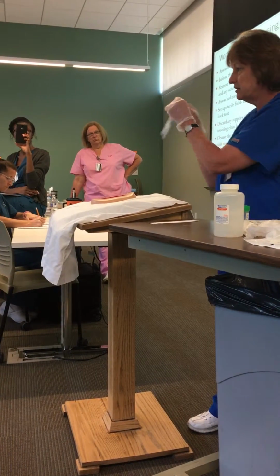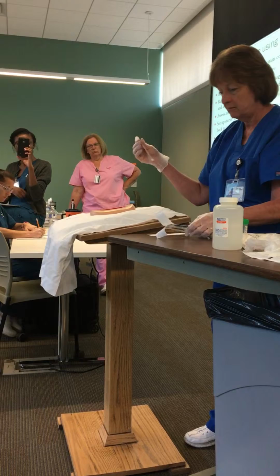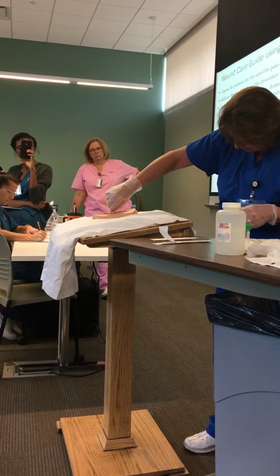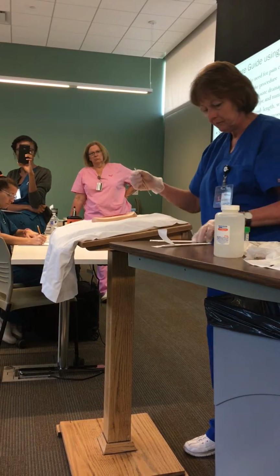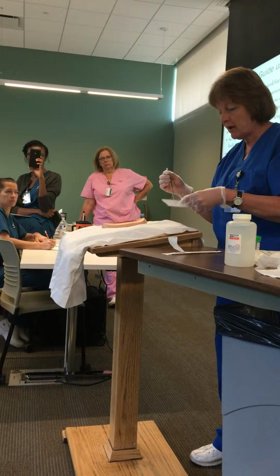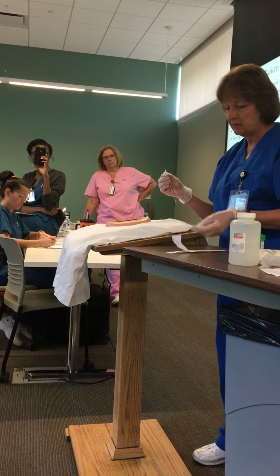So I've got my little sterile Q-tips here, and all I'm going to do is place it into the wound and come approximately over to where that comes out, and that is 1 centimeter deep. So I have 10 centimeters long, 2.5 centimeters wide, 1 centimeter deep.